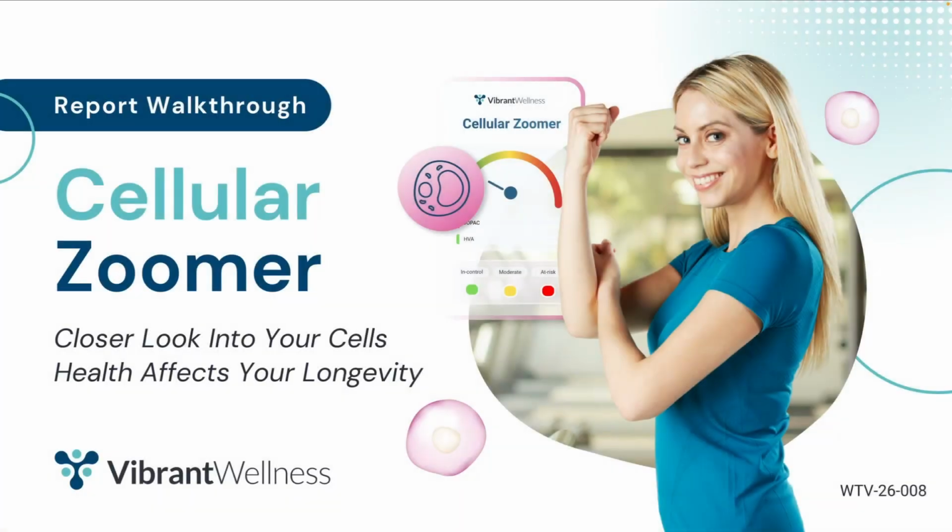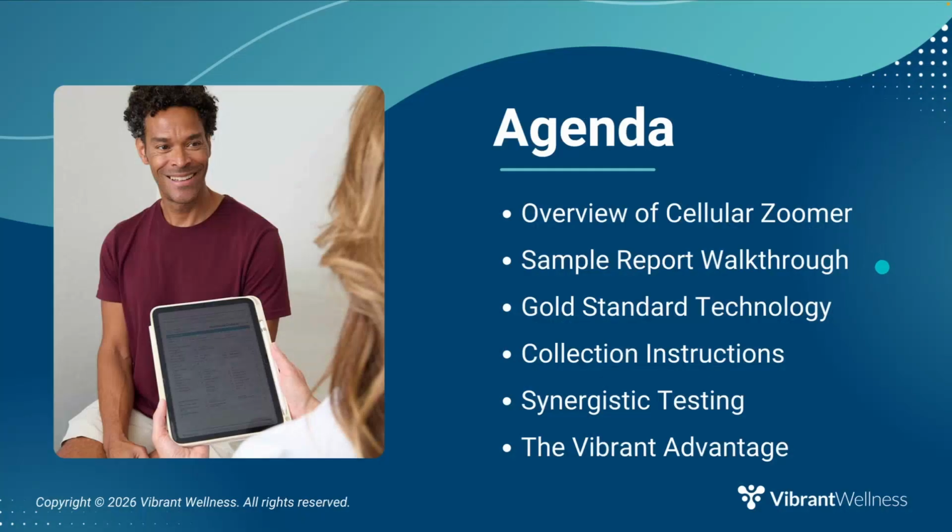In this video, you'll get a quick overview of Vibrant Cellular Zoomer. I'll walk through each section of the test, highlighting key features. Then I'll explain the technology used and briefly discuss the collection instructions. I'll also suggest synergistic tests and end by highlighting the Vibrant Advantage and where to go for additional information.